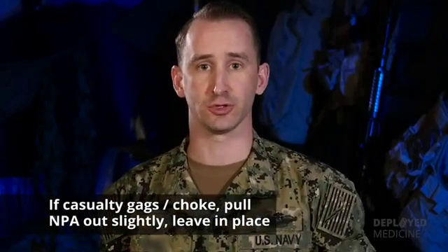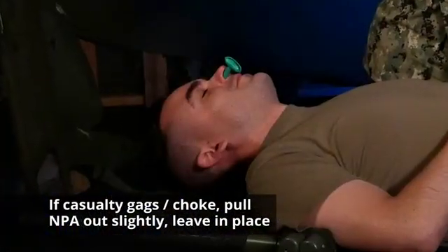Additionally, while inserting the NPA, if your casualty begins to gag or choke, you're going to pull the NPA out slightly and leave it in place.